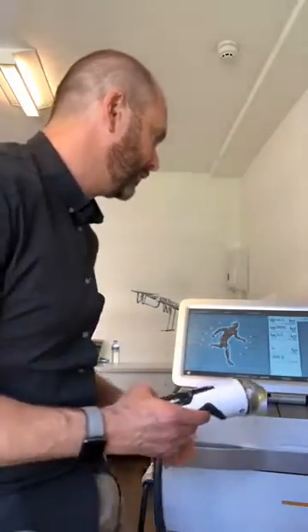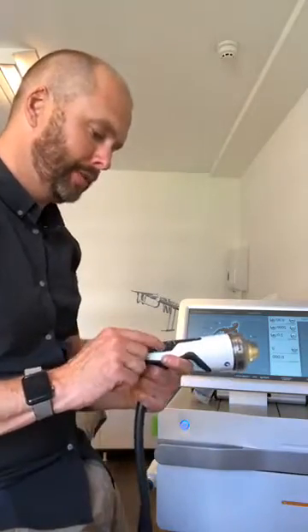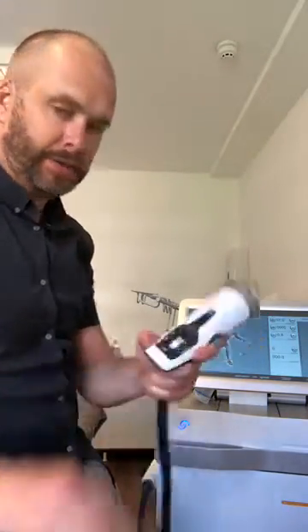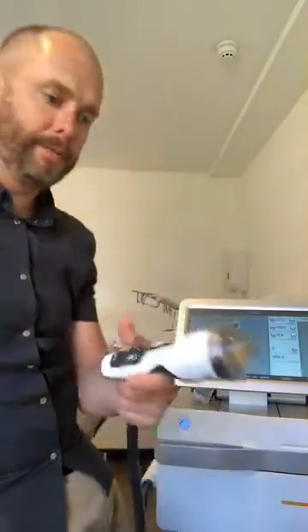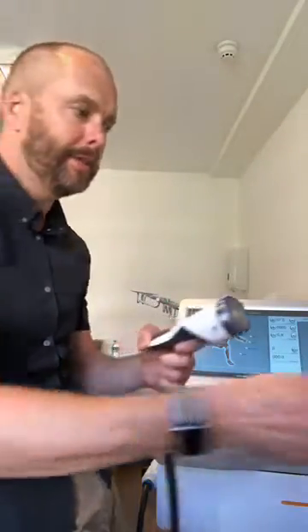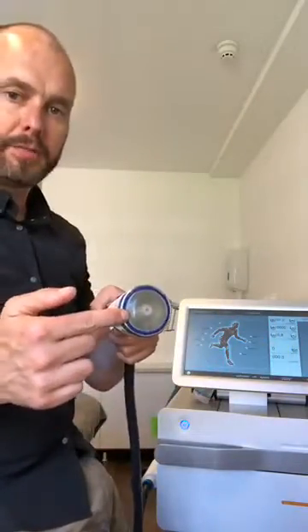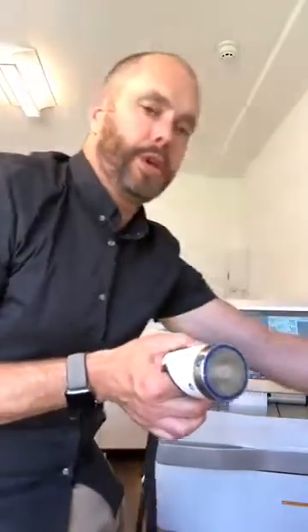Energy in millijoules per millimetre squared is 0.30 — now that's actually quite high. We'd start off usually at about 0.10, so very, very low. Now the whole point about the focused shockwave, with the standoff in place, is that it's much, much different if you compare it to the radial shockwave that you will know.